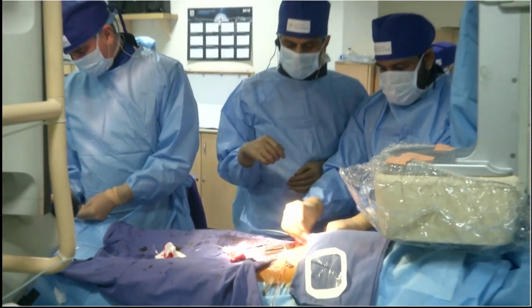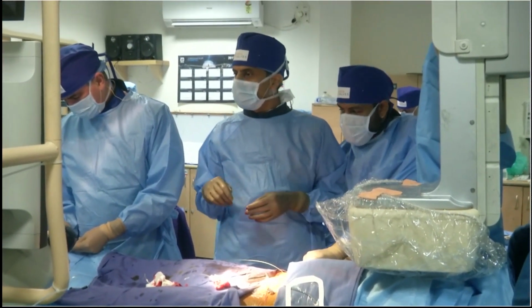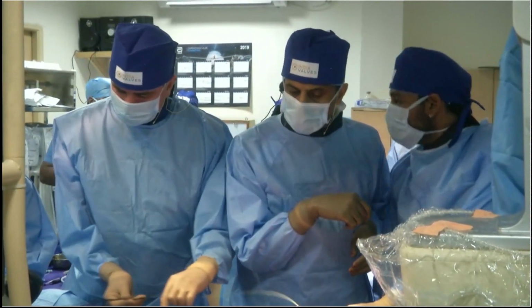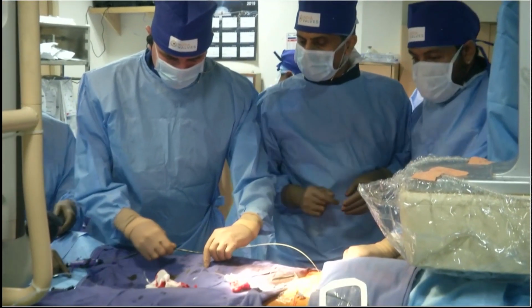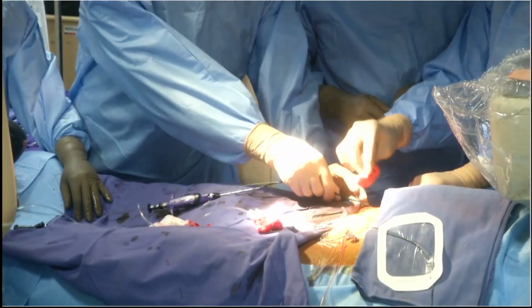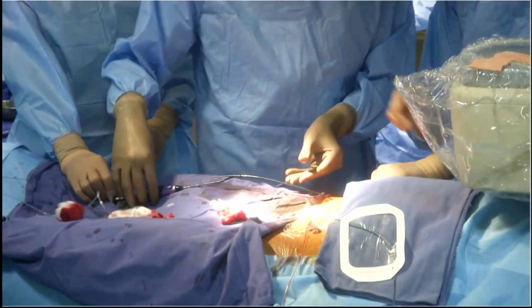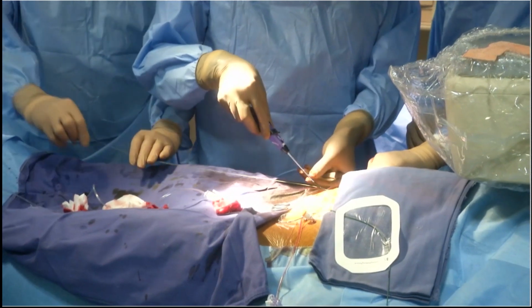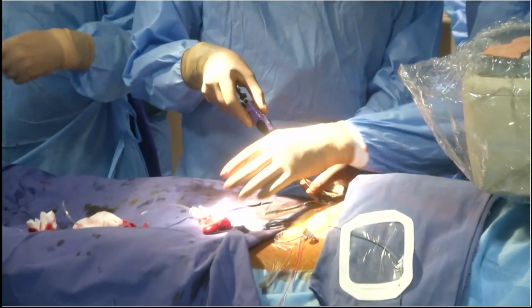What we have seen, I think Kentaro will agree with me, is that sometimes we put 2 ProGlides, but very often we get good hemostasis after deploying the first ProGlide. Kentaro also has the same experience, using 1 ProGlide in Japanese patients.